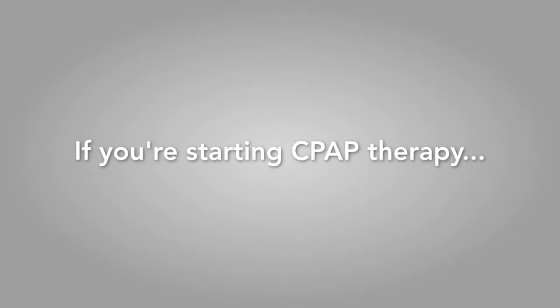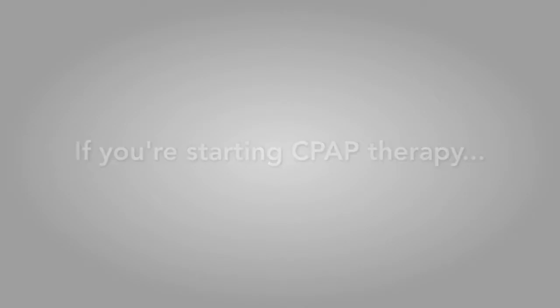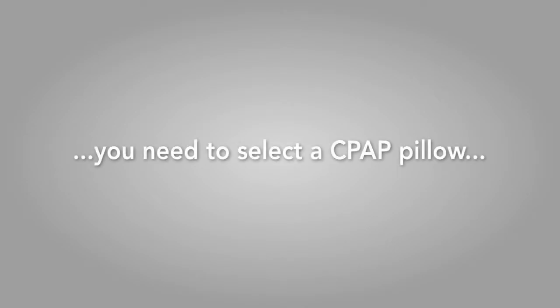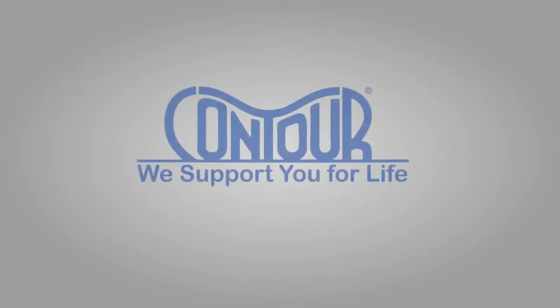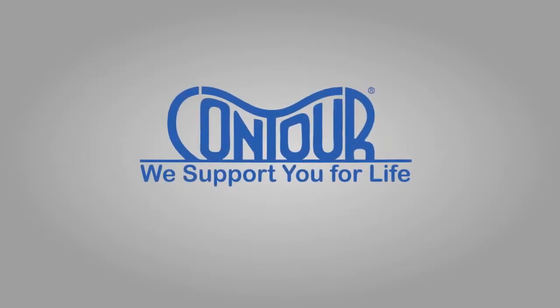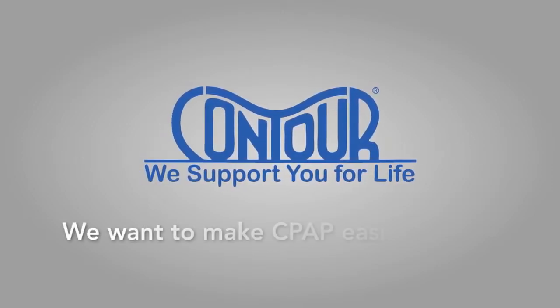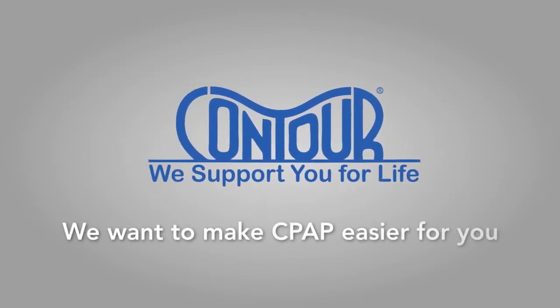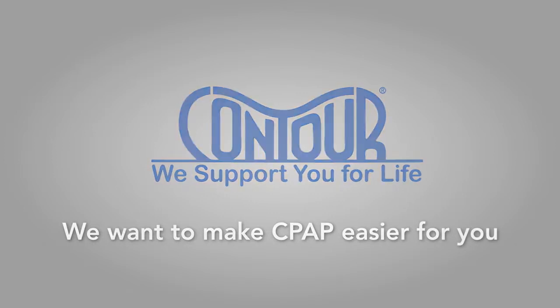If you are starting CPAP Therapy, the next important decision to make is to select and purchase a CPAP pillow. Contour Products wants to make CPAP easier for you.